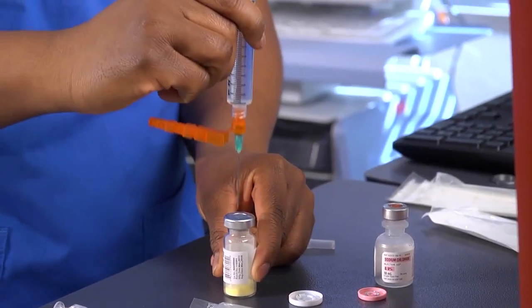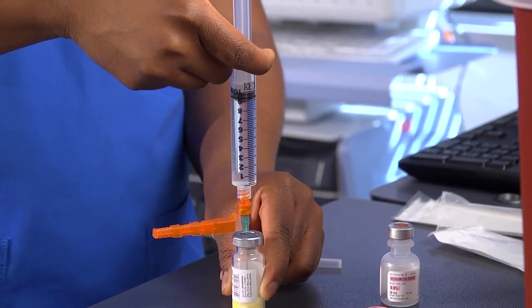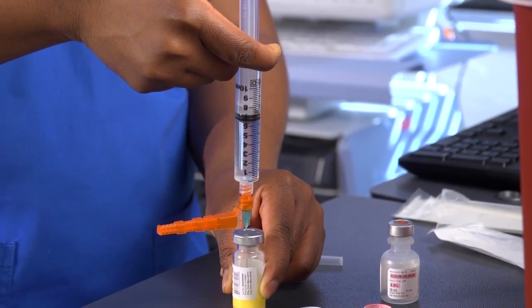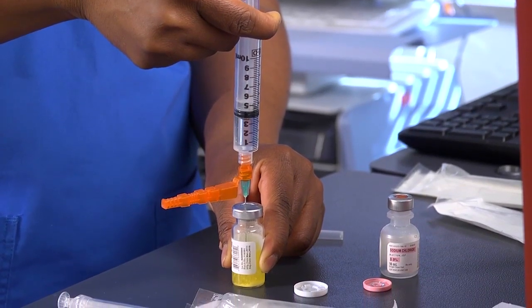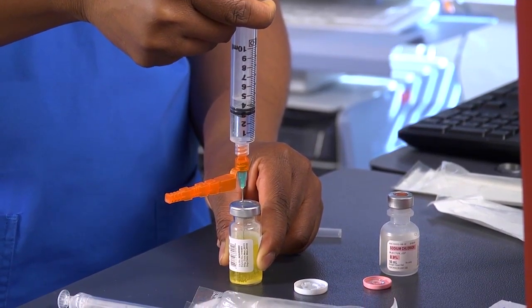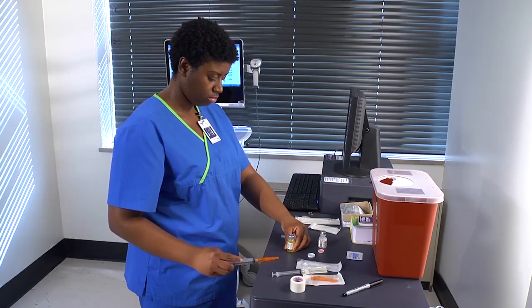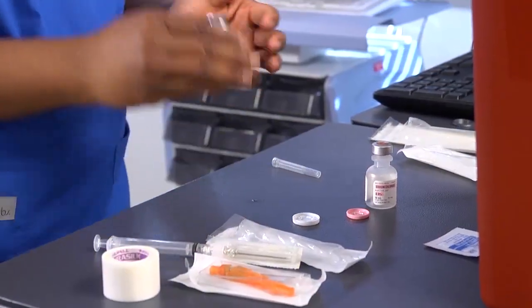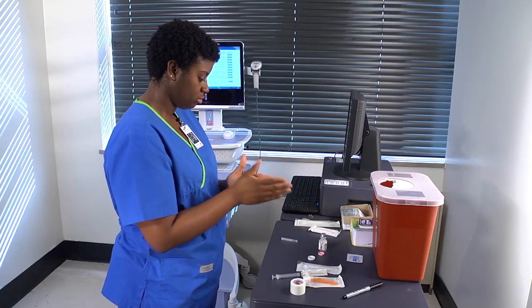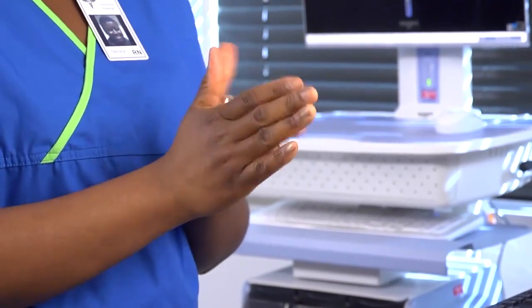To mix the diluent with the powdered medication, insert the needleless device or needle through the center of the rubber seal on the vial of medication. Inject the measured diluent into the vial containing the powder. Withdraw and dispose of the syringe or access device in a puncture-proof container. Mix the powder and diluent thoroughly by rolling the vial between your palms. Don't shake the vial.